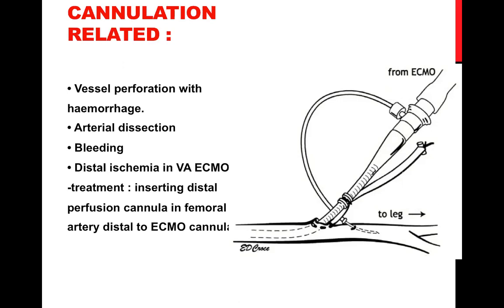In severe mitral regurgitation with severe pulmonary hypertension and moderate severe LV dysfunction, you need to anticipate the possibility of ECMO, and then you should plan your choice of bioprosthesis in advance. Bearing in mind, when you put on ECMO, don't put it as a complete unloading of the ventricle.